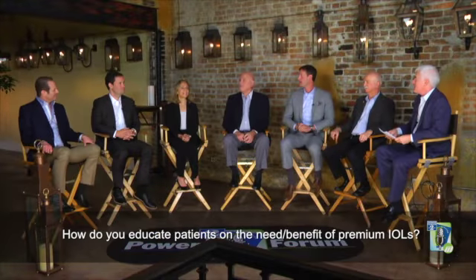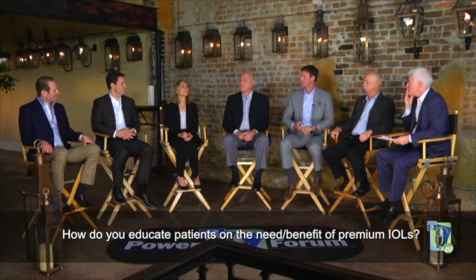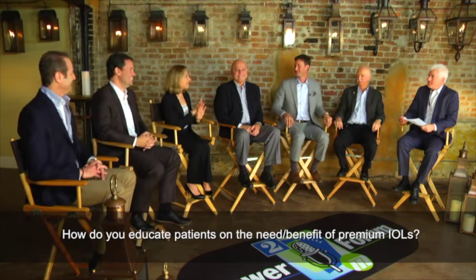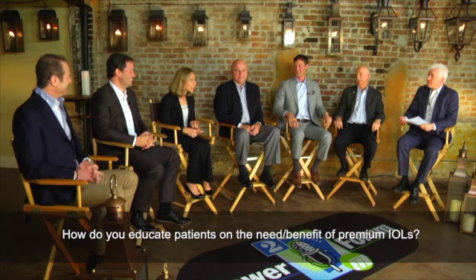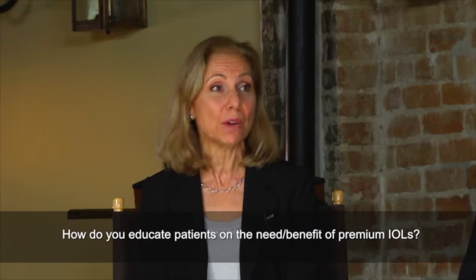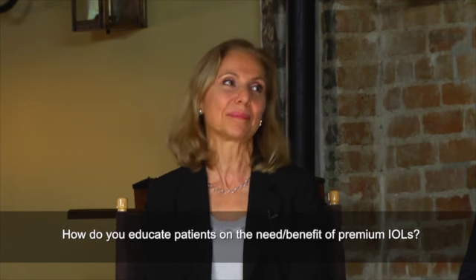Larry, what I wanted to say is that we do the same thing. I turn the monitor and show the patients the results. What I focus on is pre-existing pathology, because for me, if you don't have this discussion with the patient ahead of time, cataract surgery gave it to them, or you as the surgeon gave them their dry eye. So I take my time and really point out their ocular surface disease, their irregular placido discs, and this way they know there's something wrong pre-operatively and that the surgery itself wasn't the cause of it.